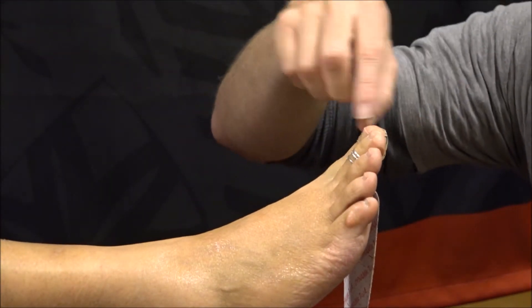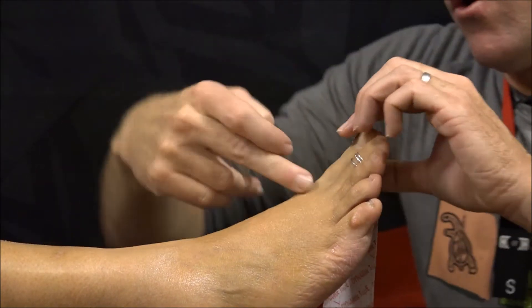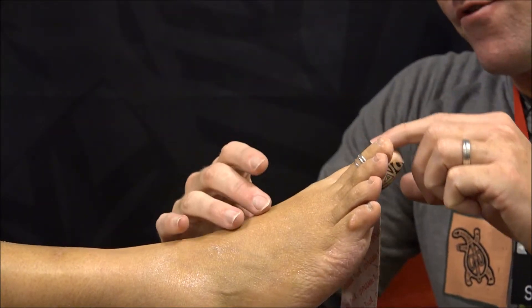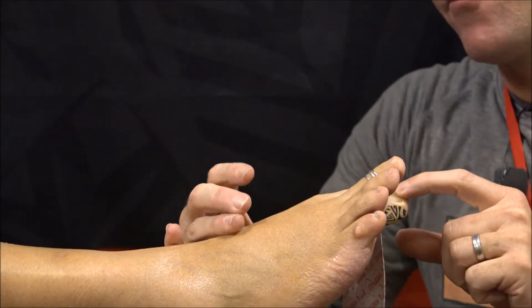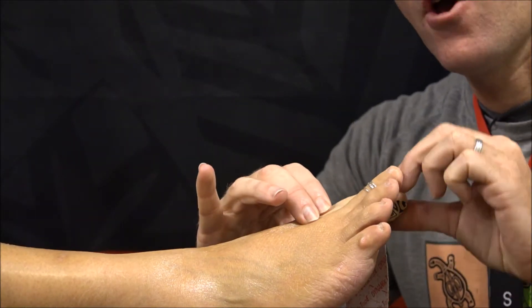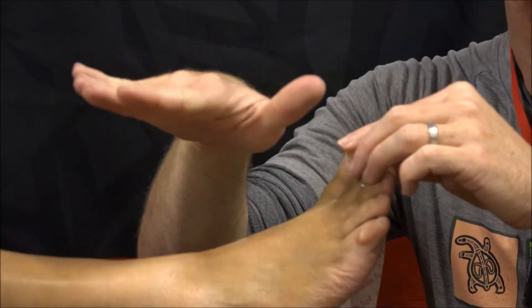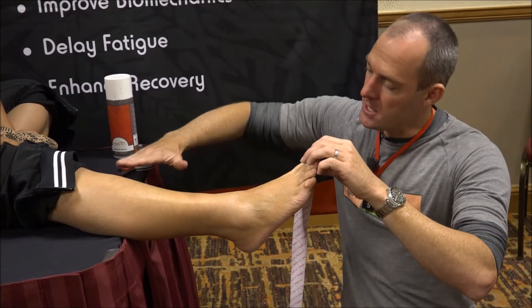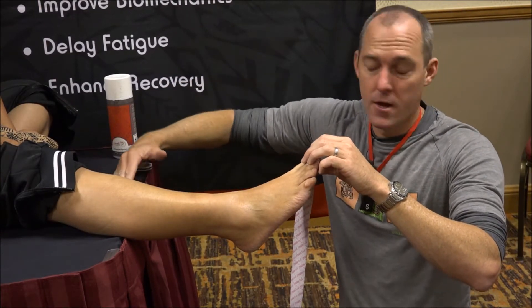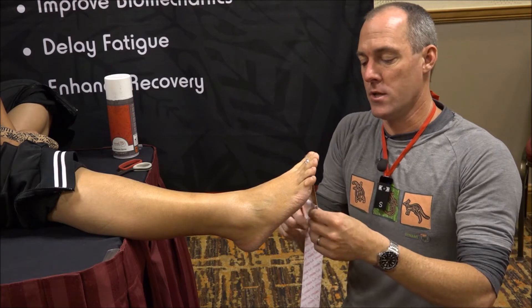I would usually put a rigid tape or something to lock that off. The reason that we come off the toe — it creates an artificial windlass mechanism. So when the toe goes into extension, it tightens up the tape, which creates more resistance to the foot flattening out, particularly between heel-off and toe-off. It's going to help maintain that re-supination to give you a better, more stable lever to push off.